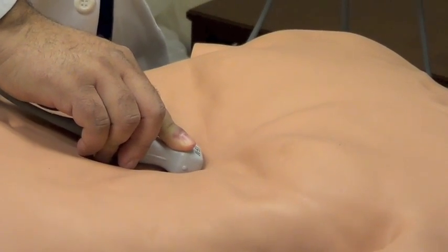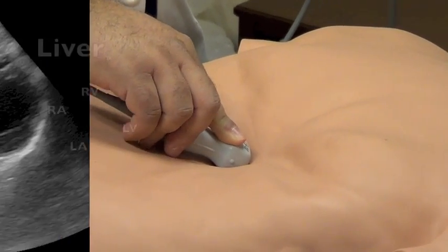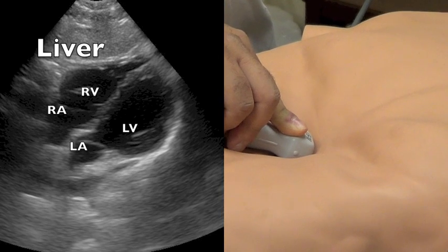Some tips to get a better view is to ask your patient to take a deep breath. Sometimes that will give you a better image of the heart.